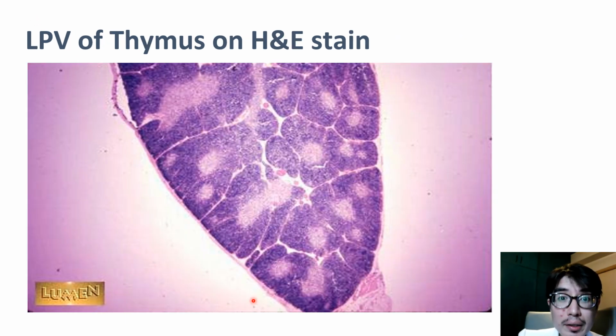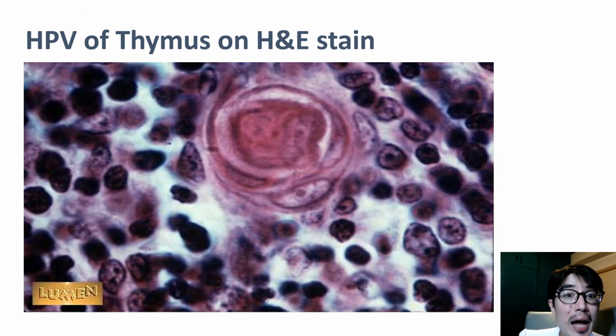This organ, the thymus, appears very basophilic in H&E stain. And at high power, the reason for the thymus's basophilia is clear, because the thymus is packed with lymphocytes with darkly stained nuclei. Isolated structures such as this whorl of cells in the center are specifically acidophilic. That is, they are eosinophilic. They have higher affinity to eosin.